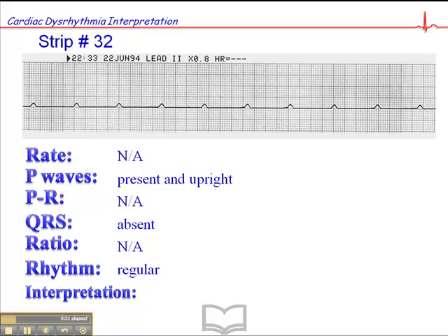The rhythm of P-waves is regular. But the interpretation of this is called ventricular standstill, and for all intents and purposes this is virtually the same as asystole.